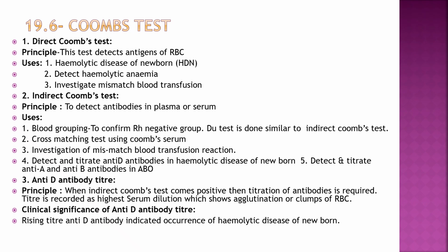And then antibody D titer: when the indirect Coombs test is positive, titration of antibodies is required. It is the highest serum dilution which shows agglutination. So the significance is that a rising titer of anti-D antibody indicates the occurrence of hemolytic disease of the newborn.